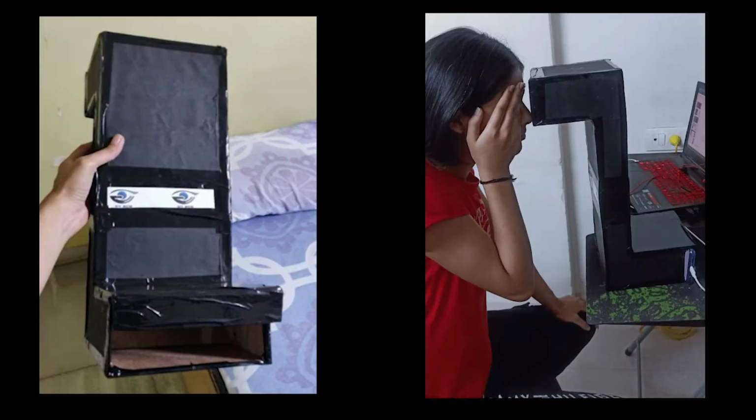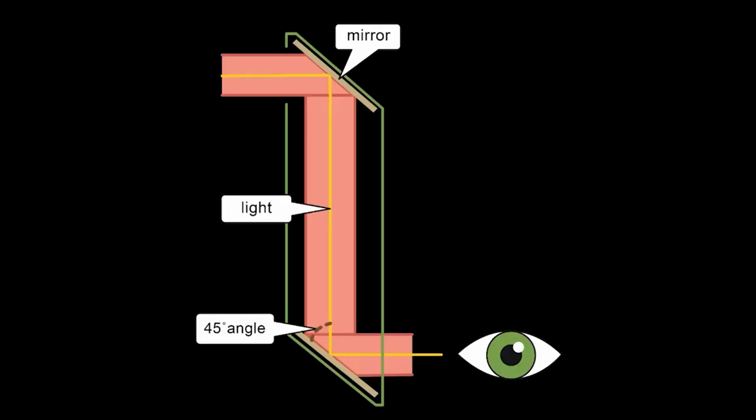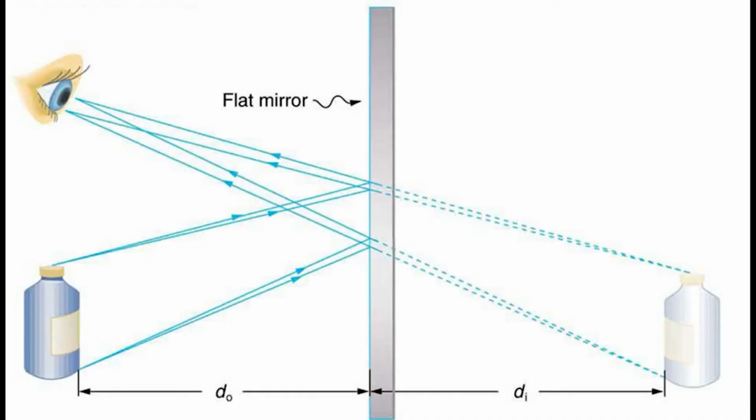If there is no proper light ambience, then the periscope is used. At one end of the periscope, a display device is mounted. The chart is controlled by the volunteer by using another remote application. At both ends of the periscope, there is a thin mirror placed at an angle of 45 degrees to reflect the light from the chart to the patient's eye. As we are using the periscope, there will be no effect of external light ambience.